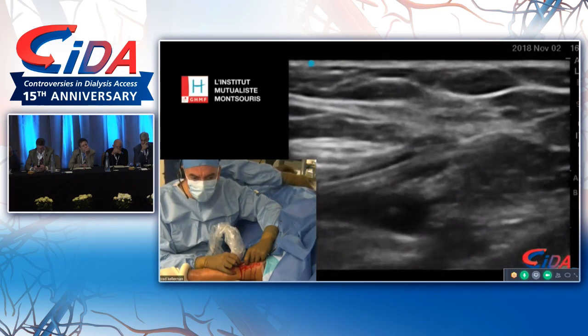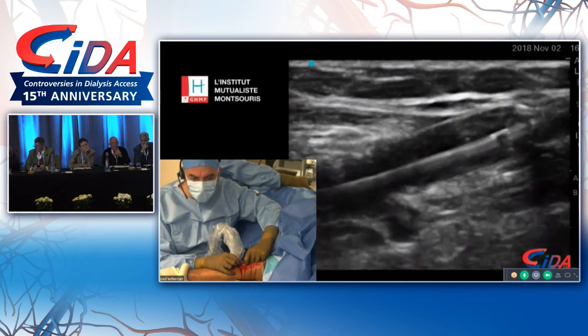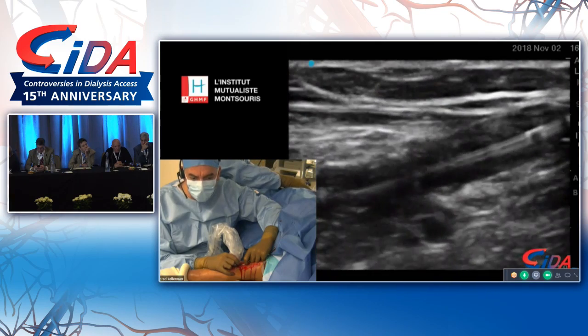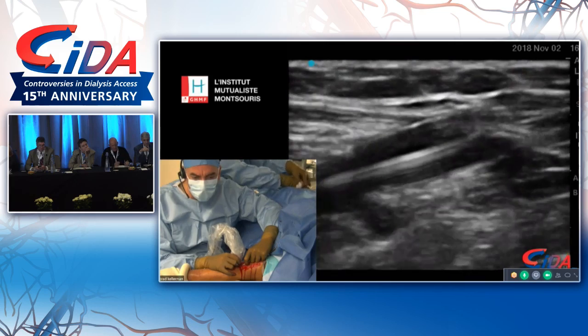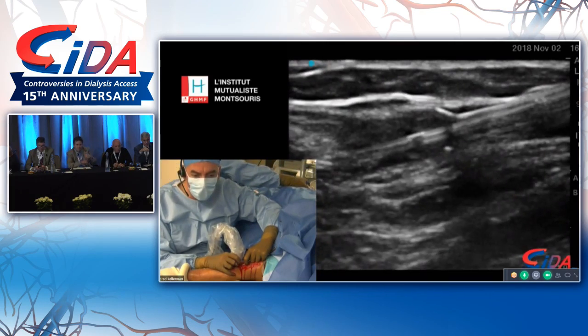And I'm going to inflate, without some specific science or evidence behind it, a few times, give it a few inflations until I feel comfortable about the final image I'm getting. And I'm feeling pretty comfortable, to be honest, right now. Okay, deflate.